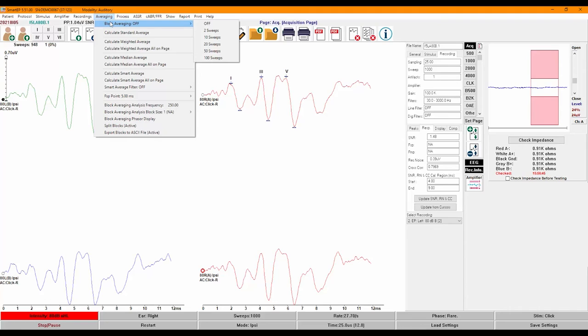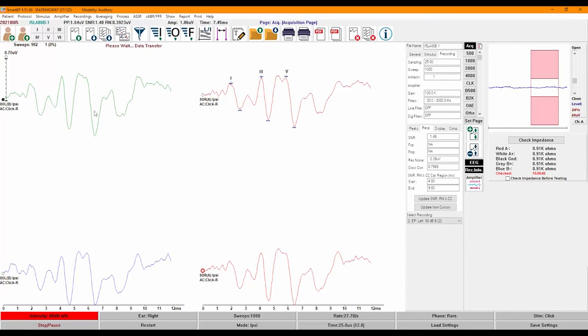We also provide a cross-correlation indication of repeatability of the response within itself based on the calculation region. FSP and FMP values can be calculated when recording in blocks, which can be activated in the averaging menu.